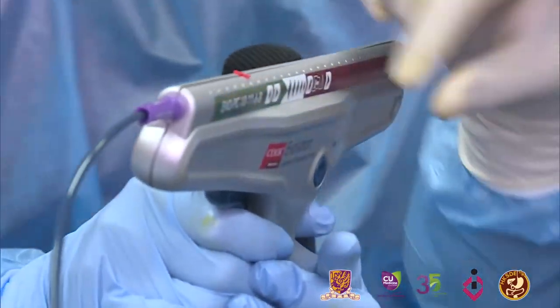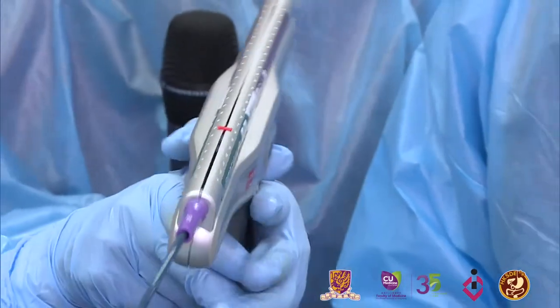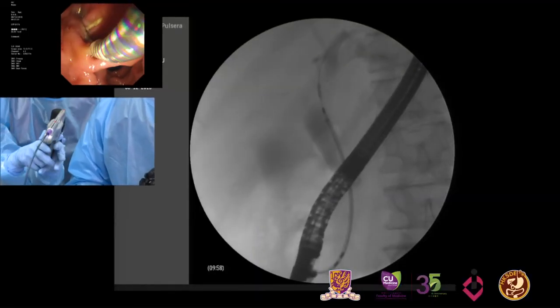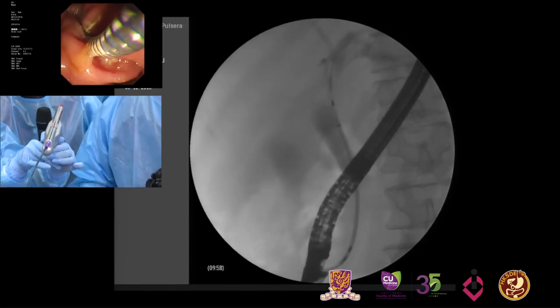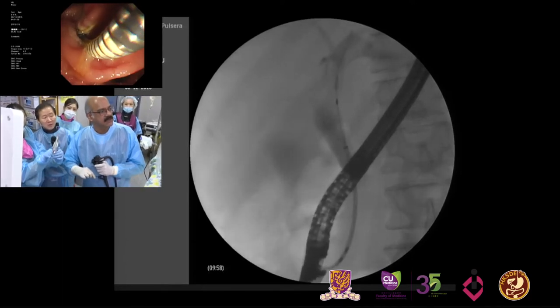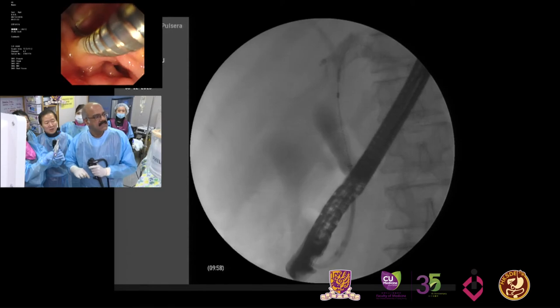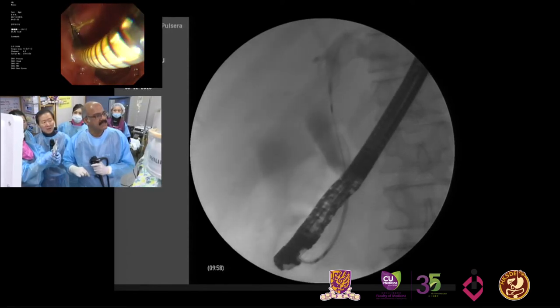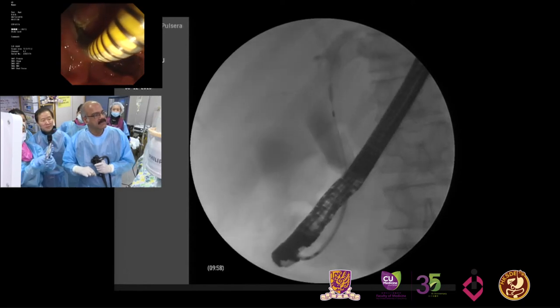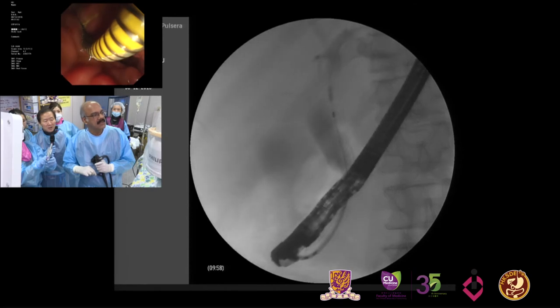If you want to reverse it, of course, there's a button to reverse it. I'm using a partially covered stent. I like to use a partially covered stent for pancreatic lower end CBD, distal CBD. That's been our experience. Now what I'm doing is pulling back as Esther is pushing the gun, because the stent tends to go up. So I want to pull back so that I see the yellow marker. That's very important. You can put it a little long also in this case because the terminal 5 millimeters is uncovered. Now you can see very nicely on fluoro.